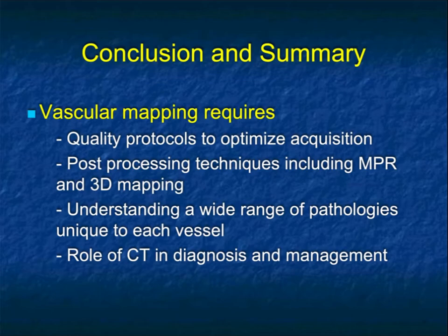So we've looked at a number of things now. We've looked at not everything because I told you we'd be here for days. And we're going to come back to more specific territories. We're going to do acute vascular processes in the chest. And we'll come back with some more abdominal stuff. But I've covered things like the renal artery, the SMA, the celiac, the whole mesenteric arcade. We looked at different pathologies.